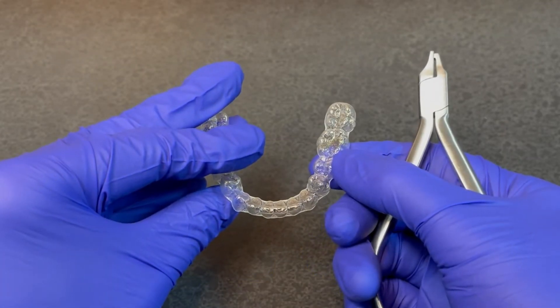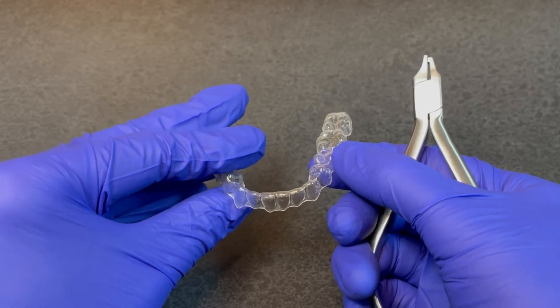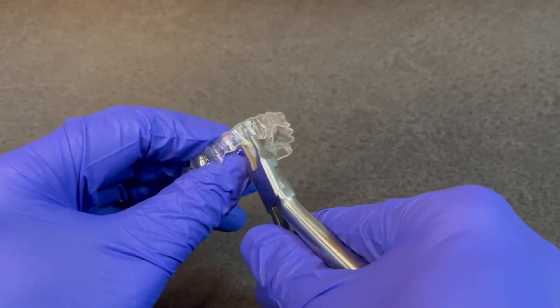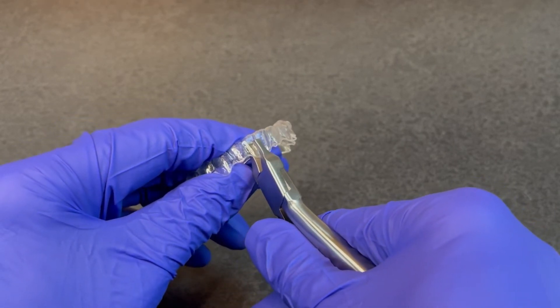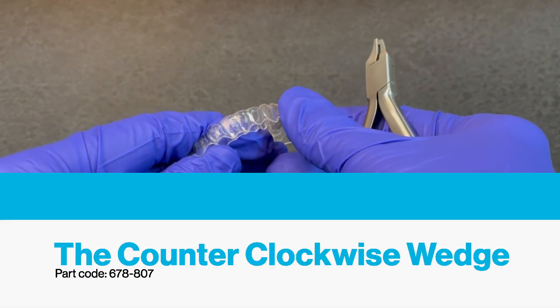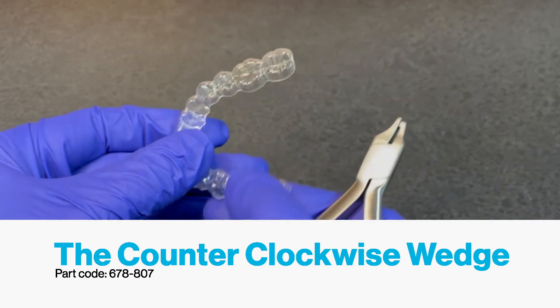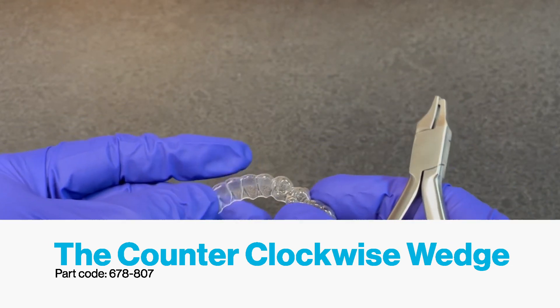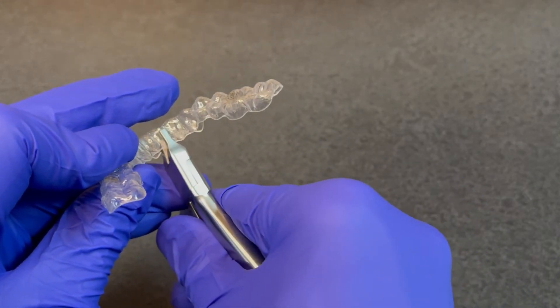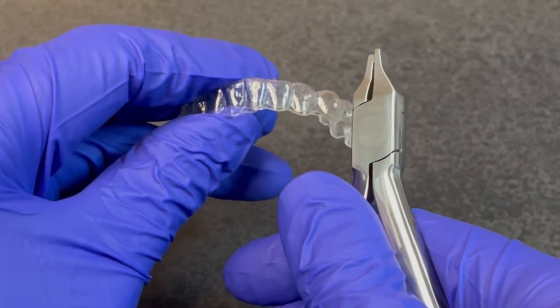In this example, we'd like to place a mesial rotation, or counterclockwise rotation, for the lower right central incisor, so we select the counterclockwise instrument. It is placed at the line angle and with a gentle squeeze, we have produced a small indent for the rotation of that tooth. To complete the rotational couple, we go to the lingual and place the indent at the distal line angle.